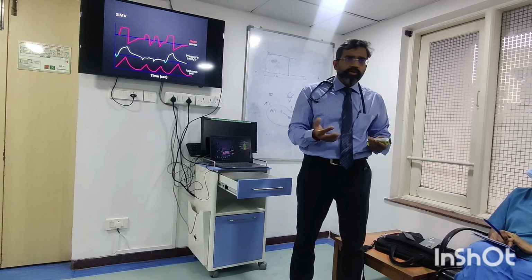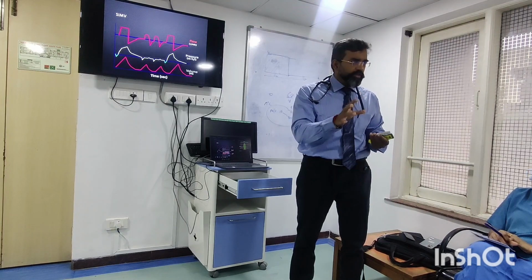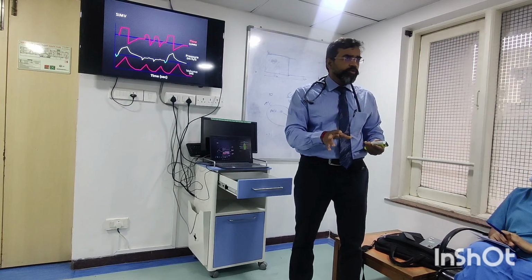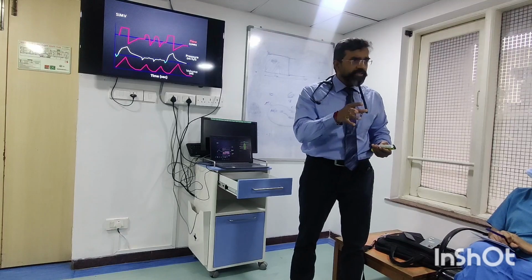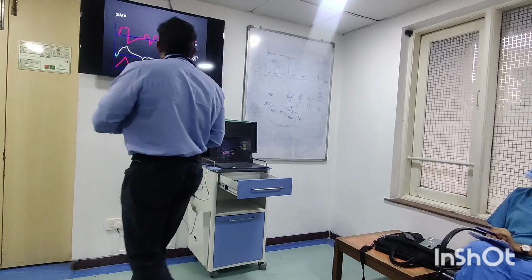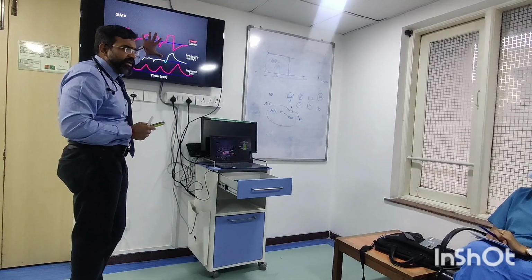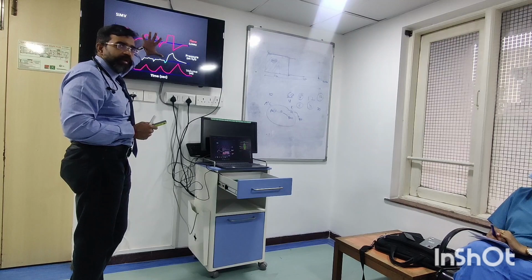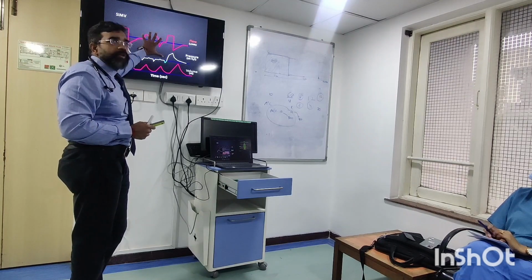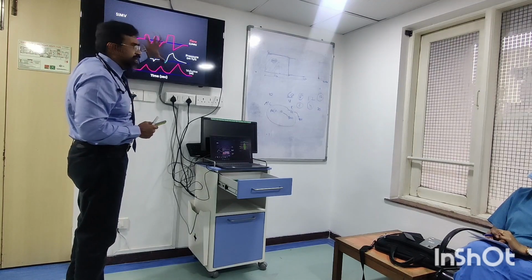So what did they do? In that phase, they created a phase where the valves could open irrespective of what mode the patient is on. So that is the birth of SIMV. What happened over here? Till now, if SIMV was not there and the patient was trying to breathe in this mode, the ventilator would not help; it would in fact harm. You try to breathe, the valve is closed. Try to breathe, the valve is closed. What it has done now is make one phase in the middle where the valves open up.